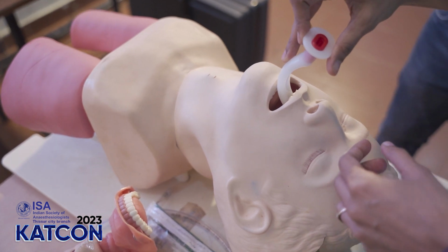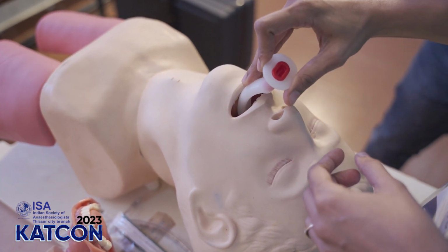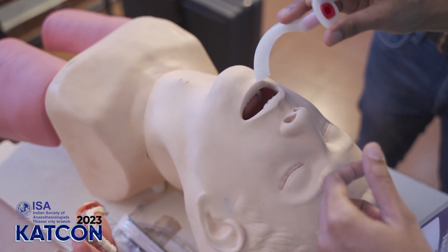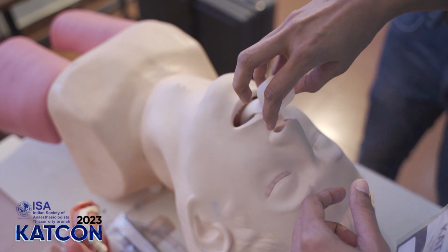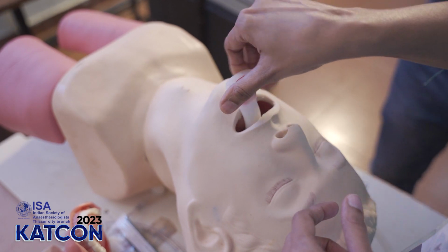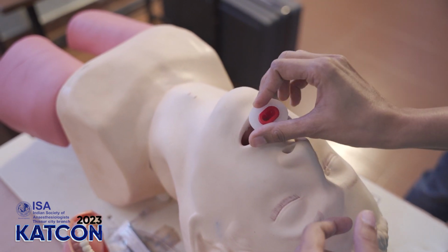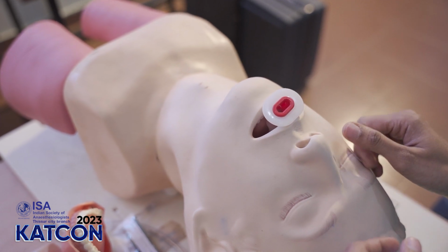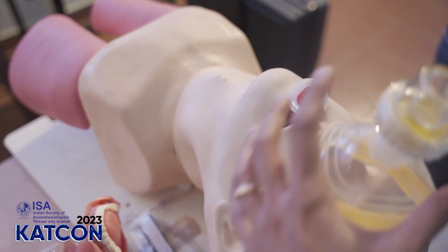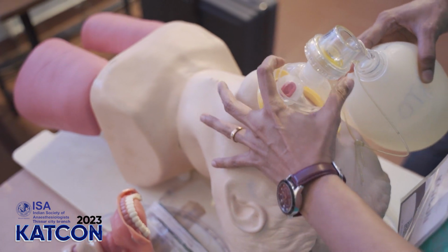You see that she is holding it upside down, inverted, and inserting it after putting ample amounts of lubricating jelly. And then she will turn it 180 degrees so that it remains in place. This is how you place a Guedel's airway, oropharyngeal airway, or simply an oral airway.